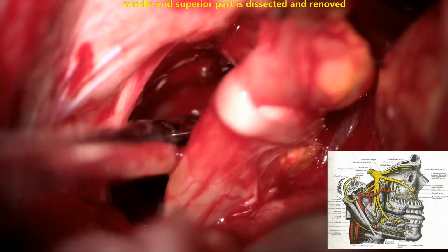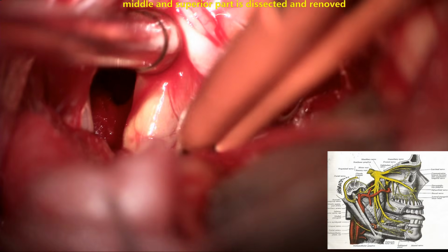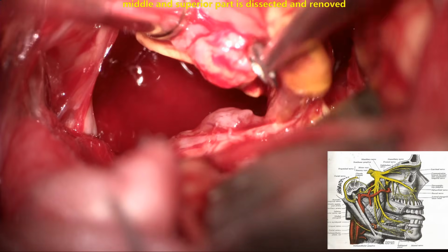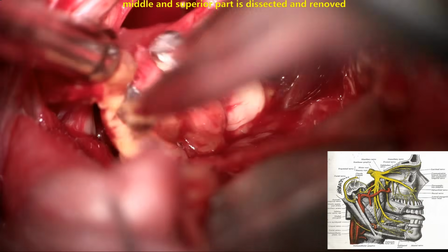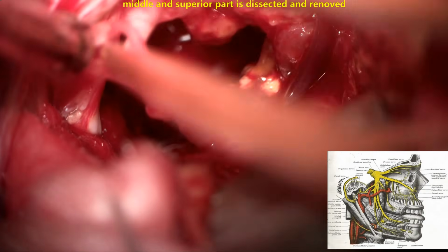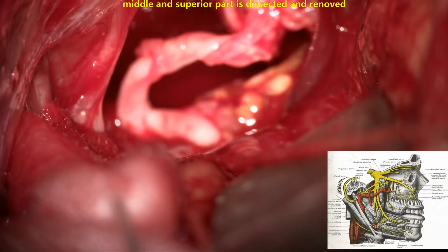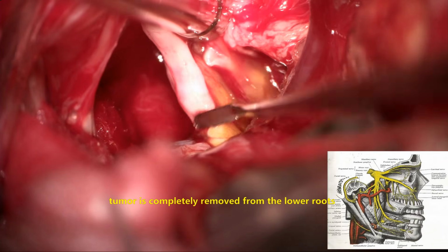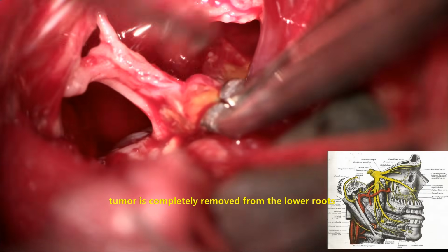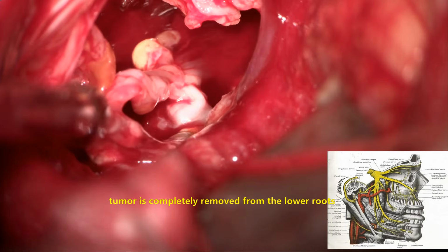This is the lower part of the tumor, inseparably fused with these nerve fibers. We try to protect these nerve fibers as much as possible. Majority of the time, the tumor usually arises from a few rootlets, and with fine dissection under high illumination and high magnification, we can preserve many of the roots of the trigeminal nerve. You can see now we have preserved a significant part of the lower rootlets of the trigeminal nerve, and the tumor is separated from there.